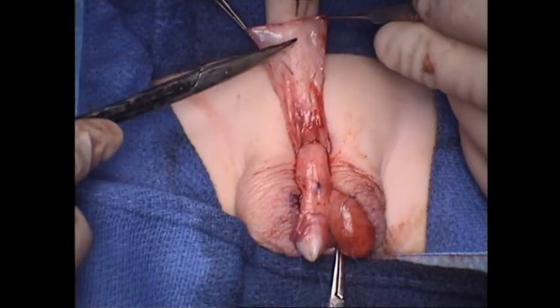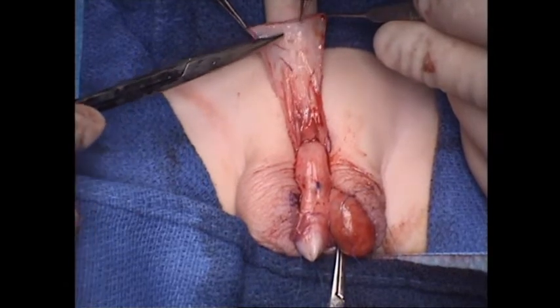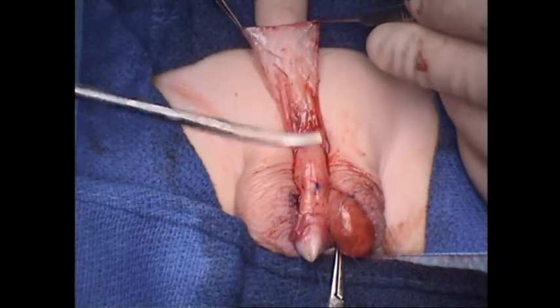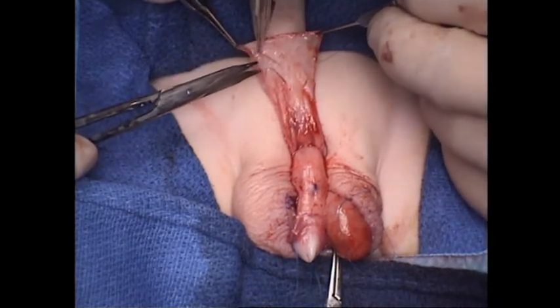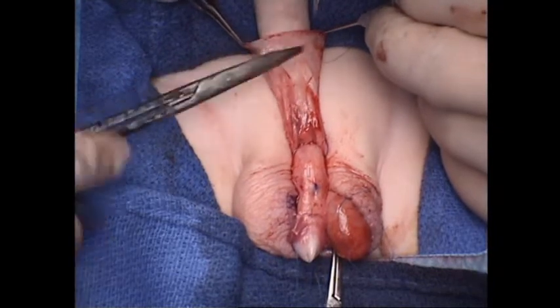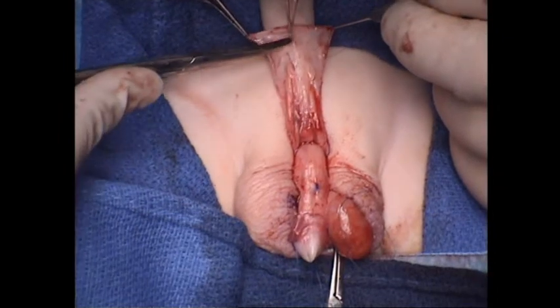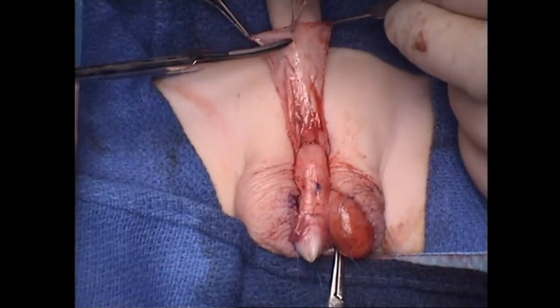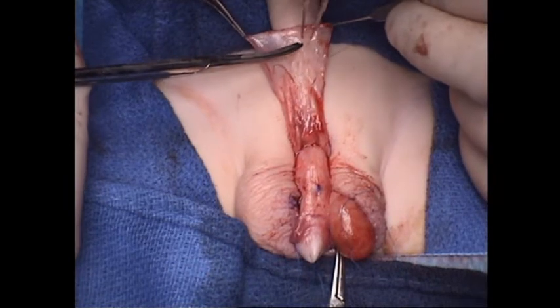You see, we spend several minutes working on this, and the interesting thing is while you do this, if you go work somewhere else for a minute and come back, it's very adherent down below. But it'll get easier in a minute. You can see it's already swollen a little bit there, and she'll be able to pick it up and cut it off. So right now we're mainly working on that area where the fold is, where the inner and outer meets.